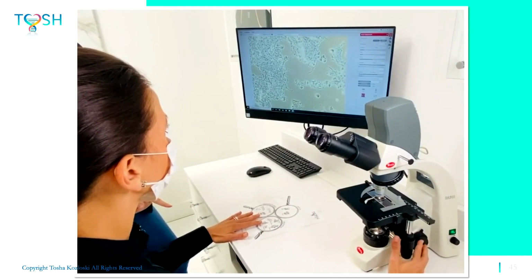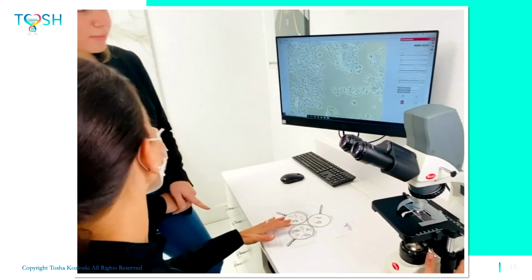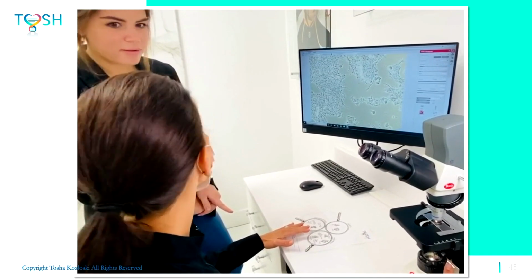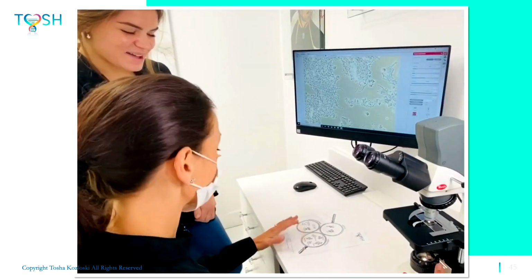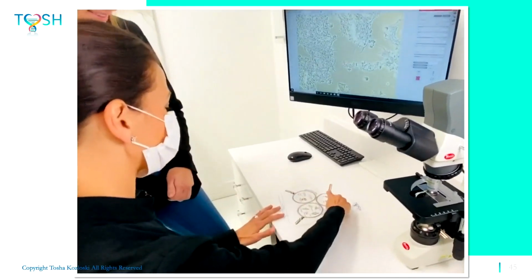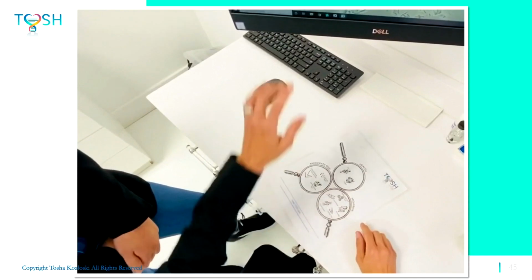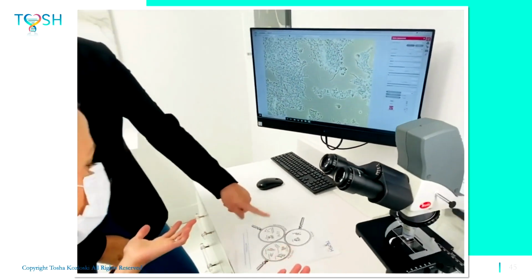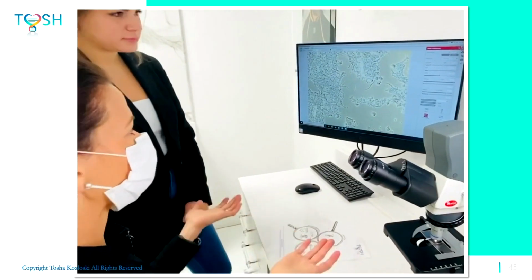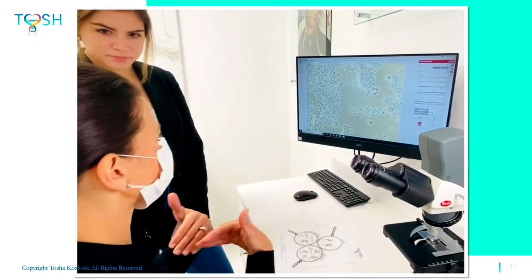All right. Well, this definitely explains why I was seeing such a change in your mouth. Crazy, right? That's my mouth. It is. So, what we look for is good bacteria, but also the high and moderate risk. So what you have going on here. So the stuff that's not moving is plaque. So that's just like dirt if you're working on your car. That's good health. Okay. Totally. Hands get dirty, they don't get infected. Get a cut, something like that, could be a different story.